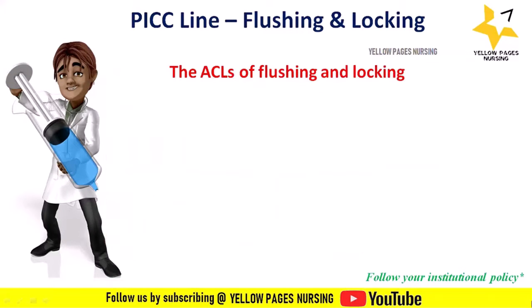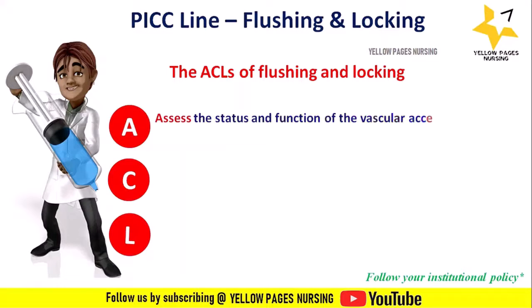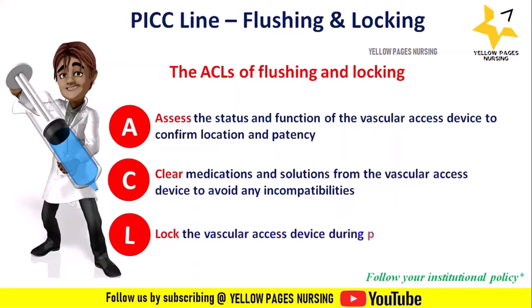The other technique for flushing and locking is the ACL technique, that is assess, clear and lock, where A is for assess the status and function of the vascular access device to confirm location and patency, C for clear medications and solutions from the vascular access device to avoid any incompatibilities, and L to lock the vascular access device during periods of non-use to ensure patency.